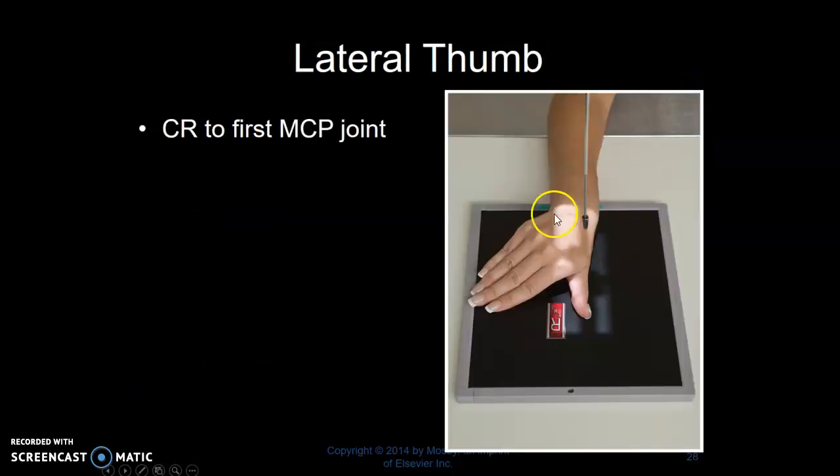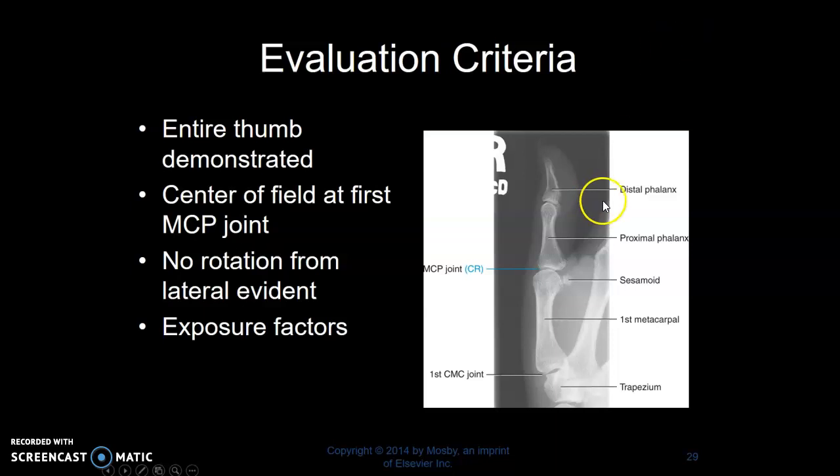Lateral thumb. I tend to have the patient make a fist, or you can have the fingers out, but you're going to bring the thumb into simply a lateral position. Centering to the MCP joint. The entire thumb you want included.